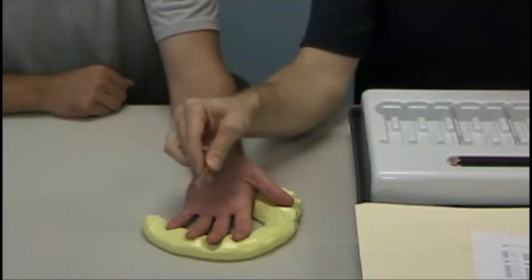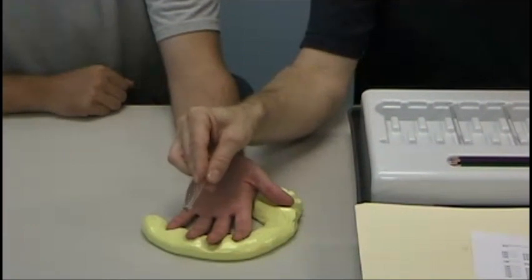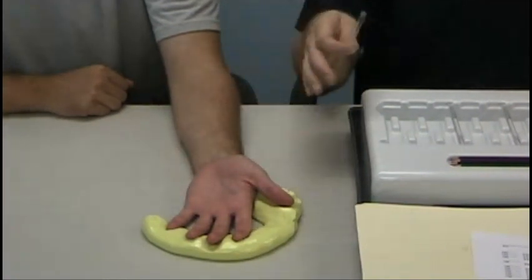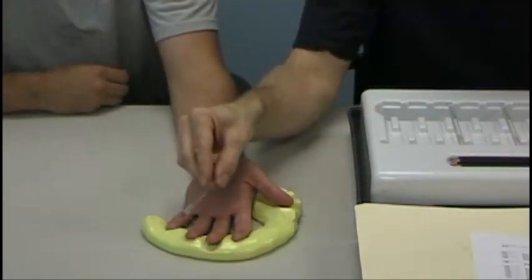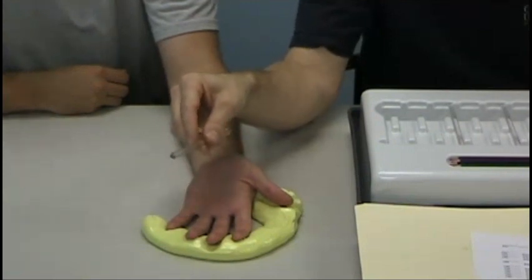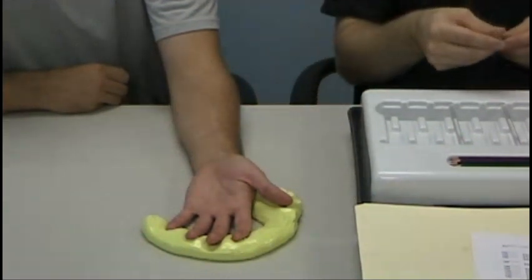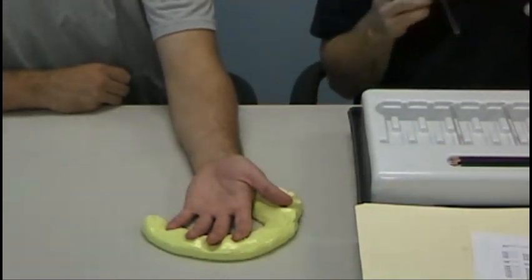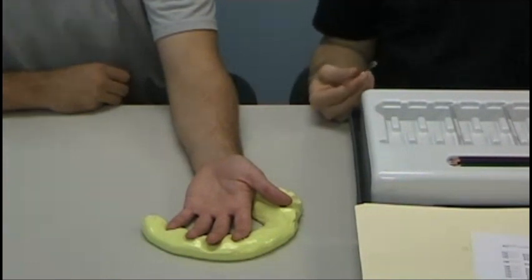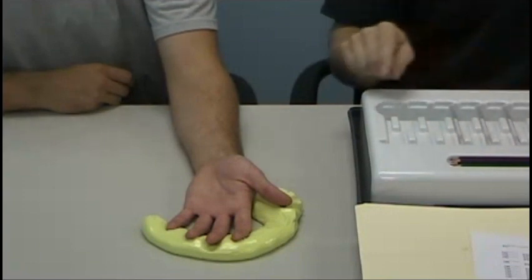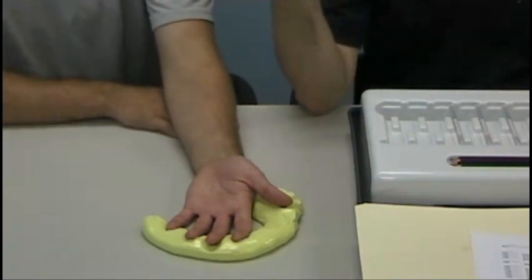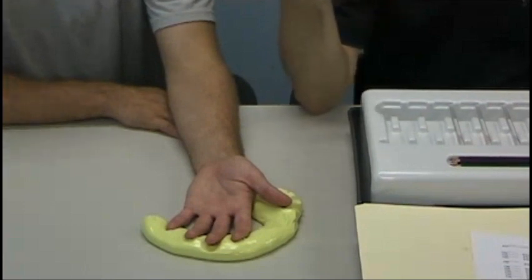To show you, you would apply the monofilament on one or the other side of the finger. I'm not doing this standardized because I would be sitting across from him with his vision occluded, but this shows you how it works. You apply it till it bends, hold for a second and a half, and then release. The patient is instructed to let you know when they feel anything and what finger they're feeling it in. There are a variety of monofilaments. Some are very thin and apply very little pressure. Some are very thick and apply a lot more pressure.